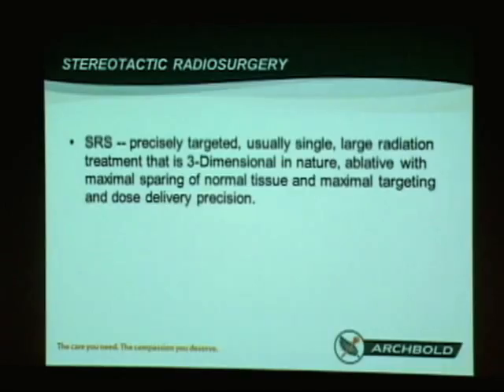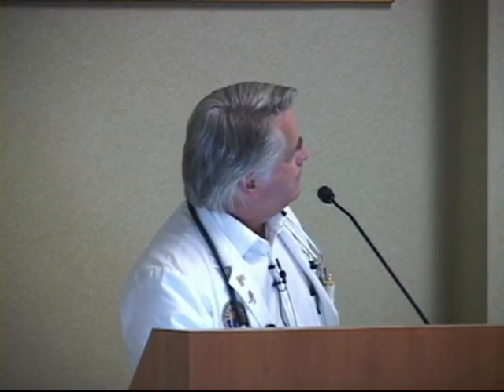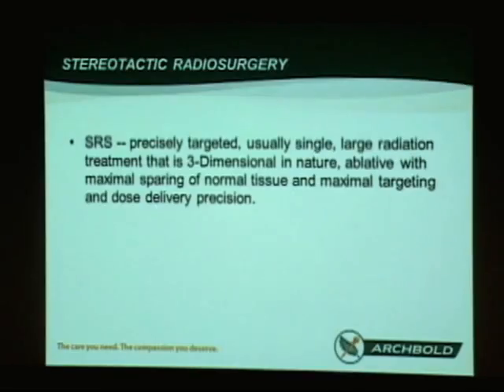So this process is termed stereotactic radiosurgery, and we shorten it down to SRS. It sounds kind of fancy, but anytime you see the word stereotactic, it means three-dimensional or XYZ plane localization. It just refers to localizing tumors in 3 dimensions, the X, Y, and Z coordinates. And then, of course, radiosurgery is surgery done with a radiation beam. So stereotactic radiosurgery means 3-dimensional surgery done with a radiation beam, and SRS is a lot quicker to say. But the implication with SRS is that there is maximum dose being delivered to a tumor and minimal dose being delivered to normal tissue. That's sort of the whole point of radiation treatment, but this takes it to its extreme.